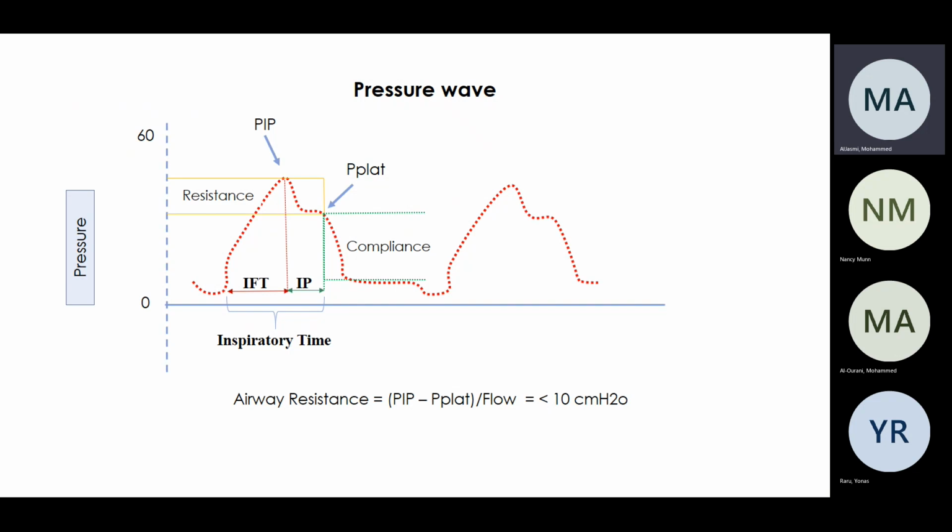How do you do it in a real patient? Have any of you done it before, guys? Yeah, third year, second year. Yeah, how do you do it? Just let me know. You went to the patient, there's a mechanical ventilation. Yeah. You see the flow over 60.